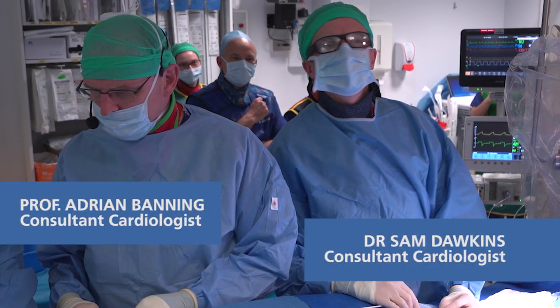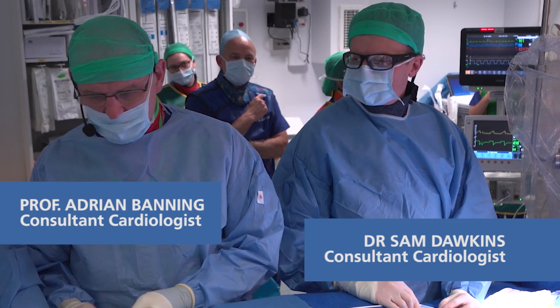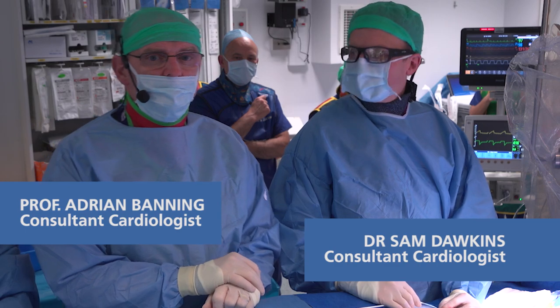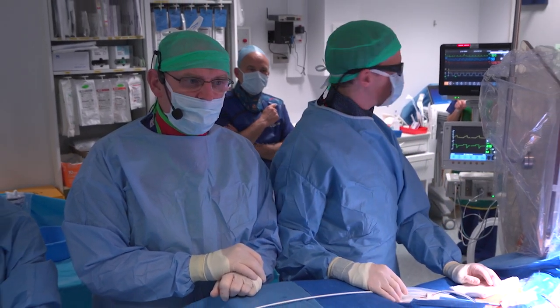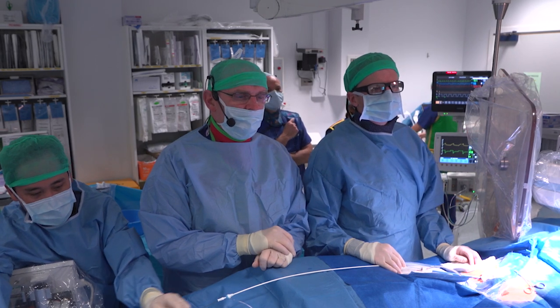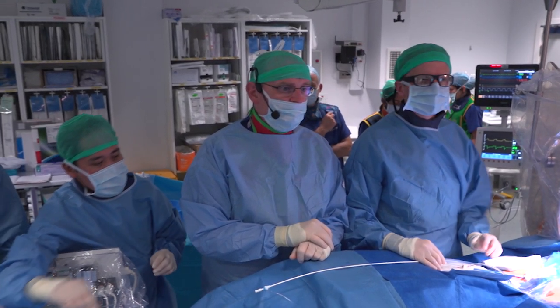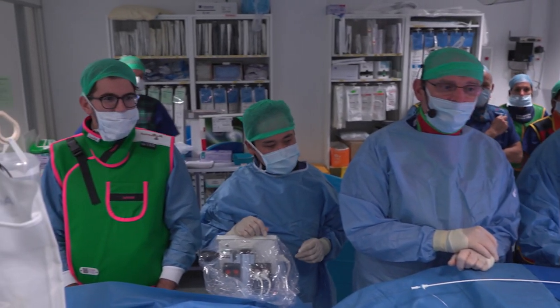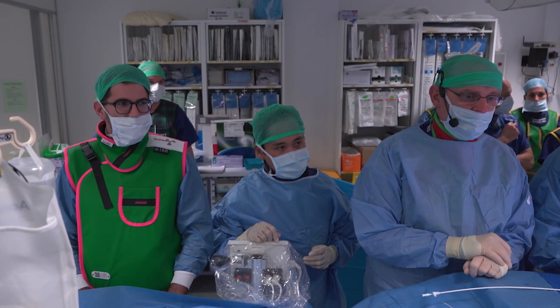Welcome to Oxford. We're just making a start on this MitraClip case. Let me start by introducing the team. Operating with me I have Adrian Banning. Our anaesthetic team are Maurizio, Rashmi and Claudia. Interventional imaging is Jim Newton. The Catlab team is Paul, Lauren, Stuart, Jersey, Heidi and Pedro. The AV team Chris and Jim, and from Abbott we're being supported by Will Winder.